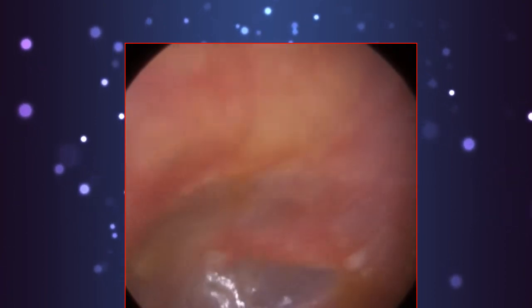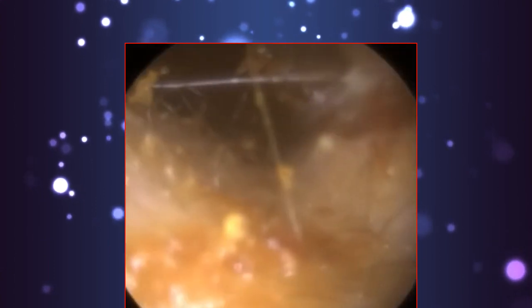You can just see how bendy this is. I hope that there's the eardrum, nice and healthy, but I don't know if you can appreciate the bends there, where we're going up and then to the right and back to the left. So left ear done.